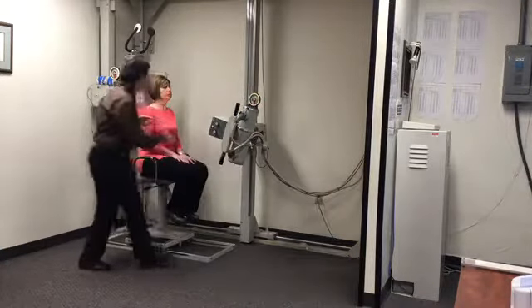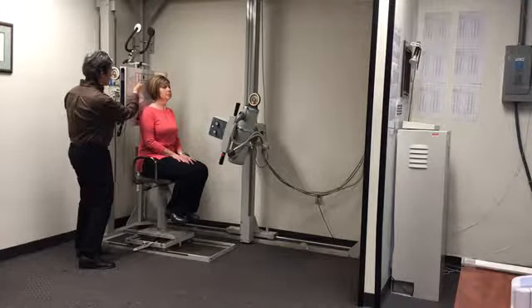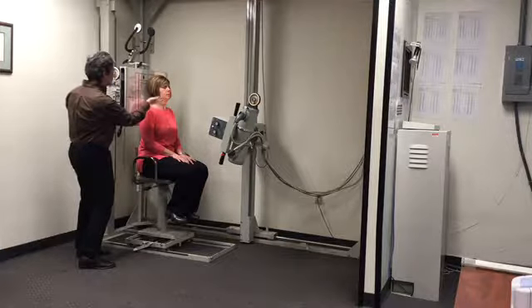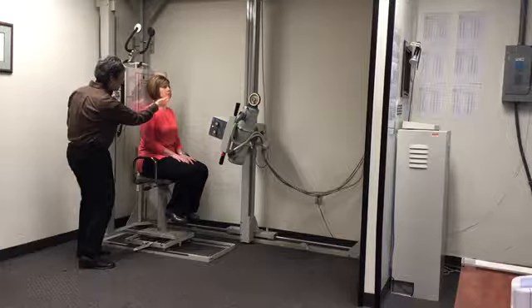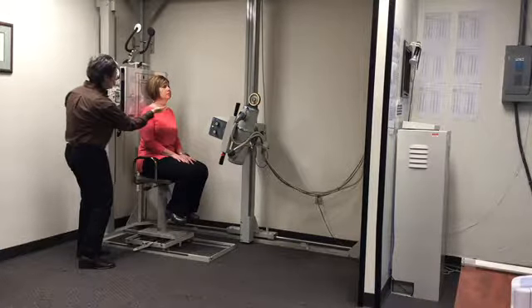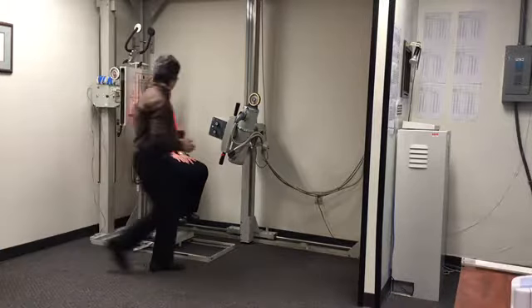Usually when you raise the patient's chin, the occiput will get closer to the bucky, and sometimes it will touch the bucky. So if it does touch, that's fine. If it doesn't touch, that's okay as well, as long as the patient holds still with the chin up. We should be fine. Now, there's a little clearance between her occiput and the bucky, and I'm not worried about that.